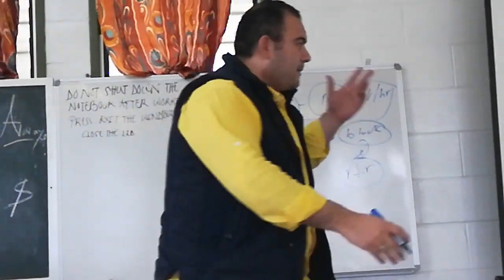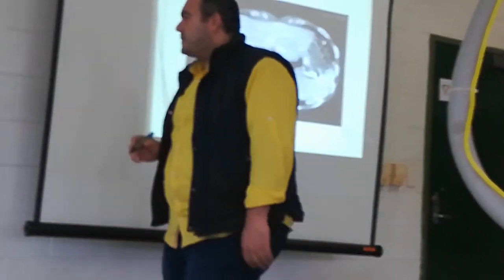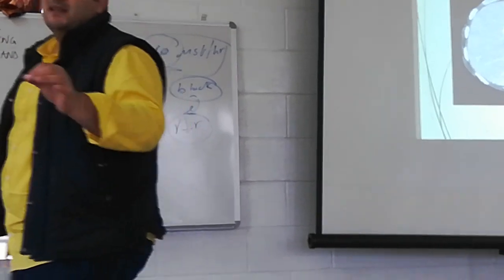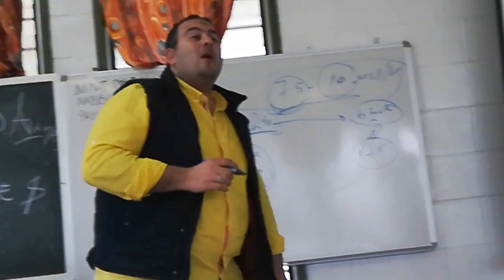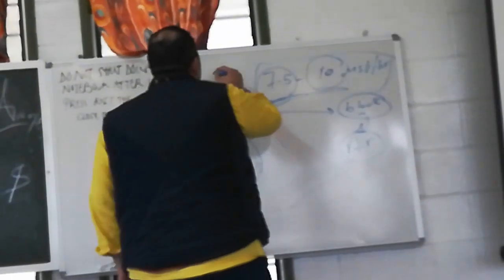You'll find water, or fats, at different degrees. Each one of these degrees is represented by the gray scale, and by what's called the Hounsfield unit, HU.